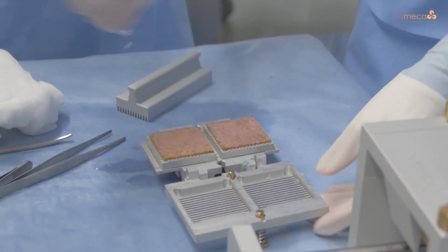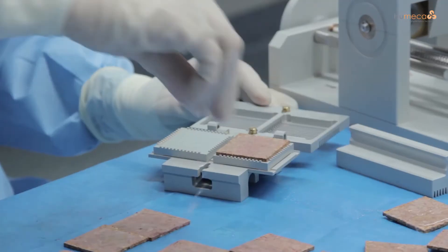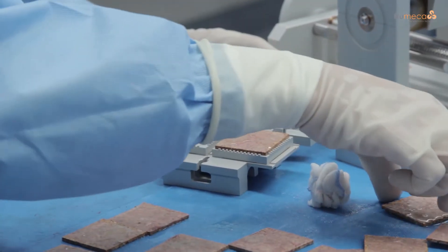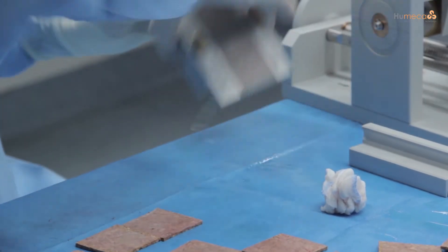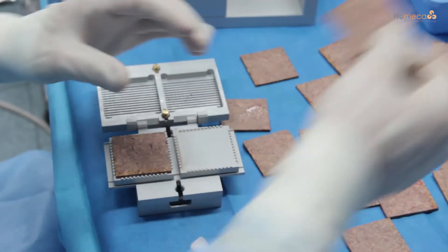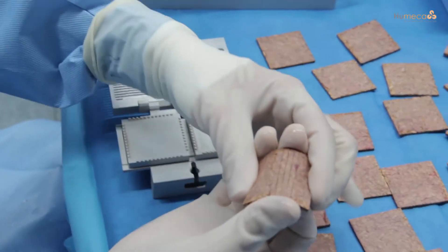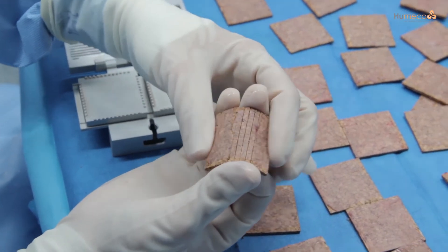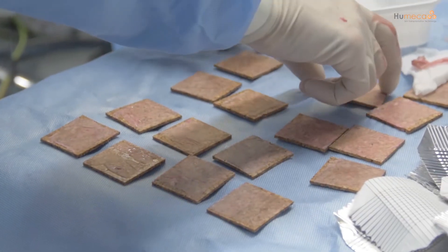Moisten the inside of the cover of the double block in between cuttings. Always place a second cork plate in the other cork holder to facilitate optimal cutting of the graft. Check if the cut has been done twice by bending the cork plate gently. By cutting the cork plate twice, 196 individual skin islands have been created.